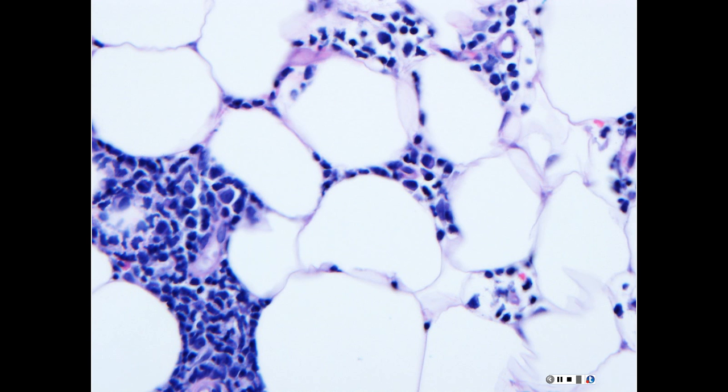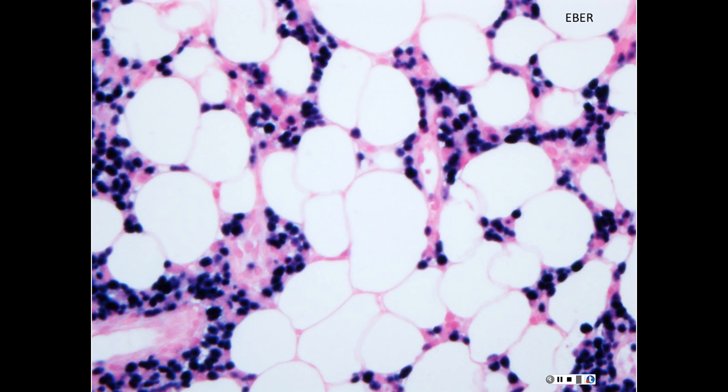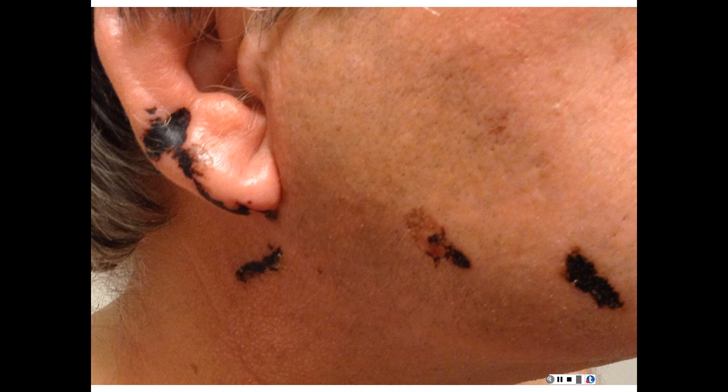There was histology, and here are angulated hyperchromatic cells rimming the lipocytes, which is lymphoma. This usually is a cytotoxic lymphoma, which is why it's destroying tissue. And EBER positive. So EBV associated. So hydroa-like lymphoma, and the follow-up was she is clear and doing well. Great credit to them and the work they do.